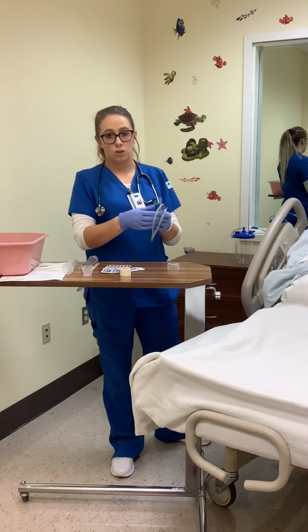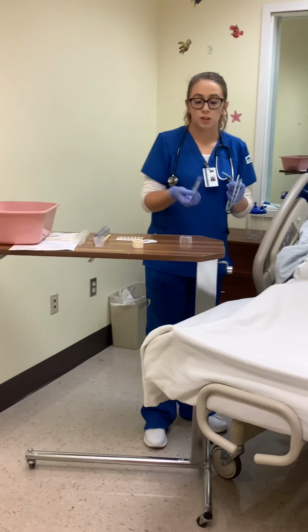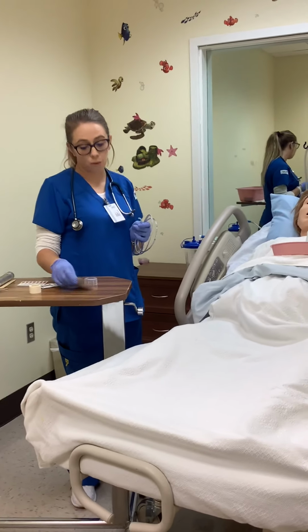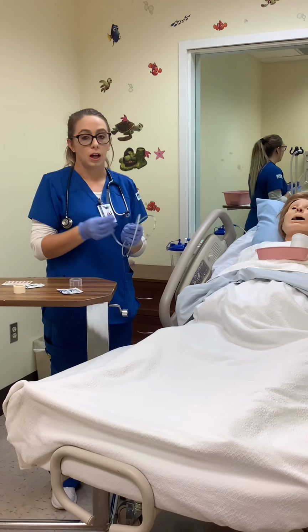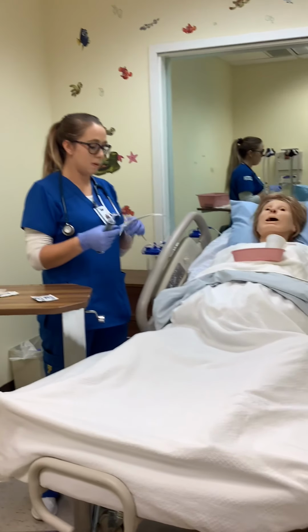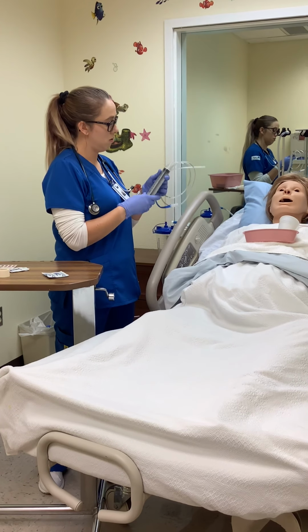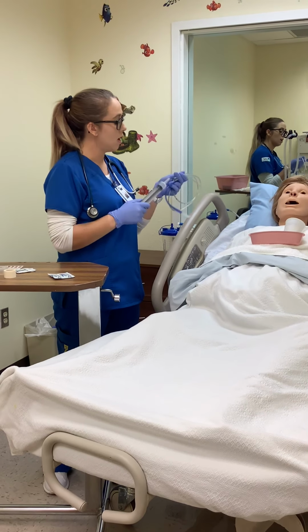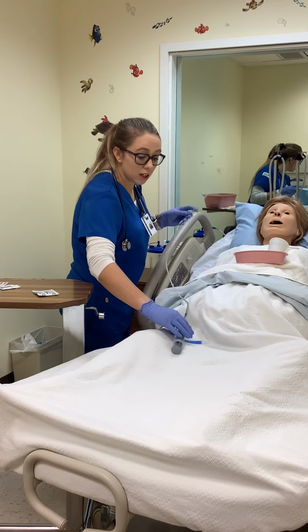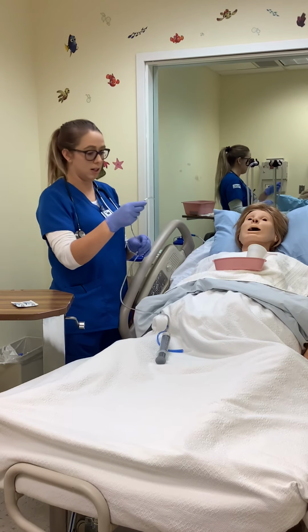If the patient's unsure, make sure they blow their nose. So what I'm going to do is put 3 to 4 inches of water soluble lube on. For the purpose of the video, we don't want to do this on the dummies, so we sprayed lube before we came in. I'm going to put 10 milliliters of air in this syringe and hook it to the bottom of the tube. This is for when I insert the tube. Any leakage or anything that wants to come up can go directly into the tube, without any squirting or pressure.